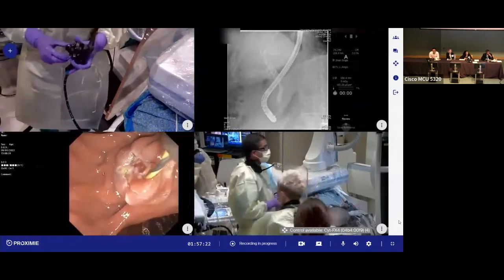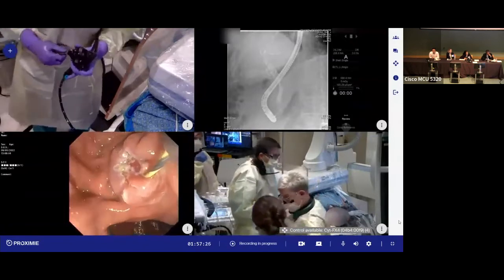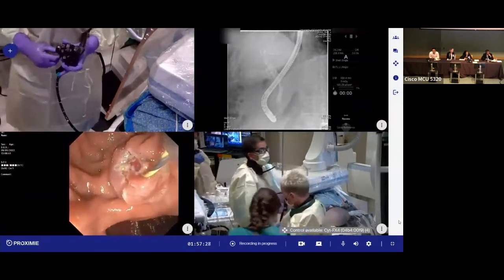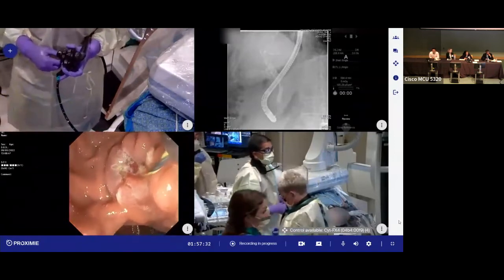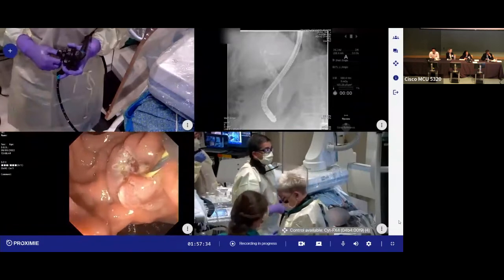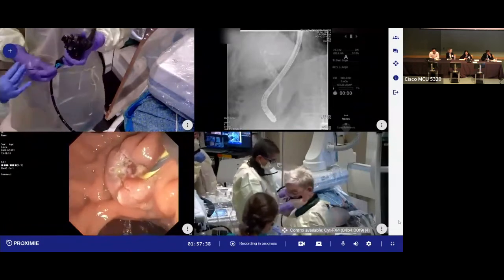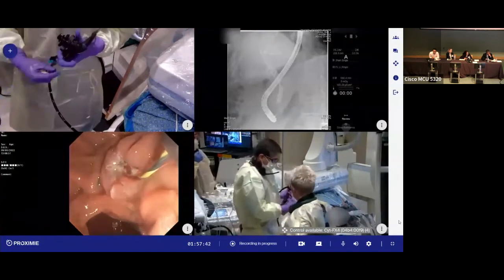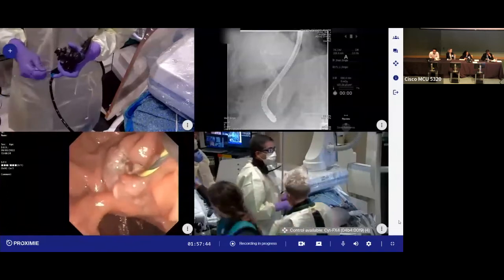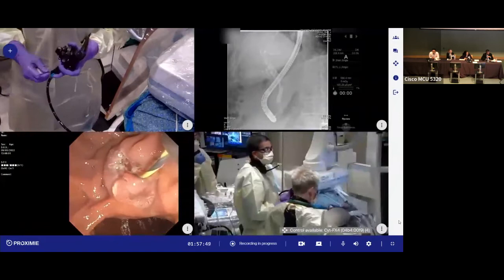Yes. I think you will see that patients will have, just above the papilla, a little bit of fibrosis or even a short segment stricture that's inflammatory, and you have a lot of trouble getting to it with the sphincterotome and cutting through it. So I think that's maybe another advantage of the dilation, as you break that up, and it speeds up the case, especially with multiple stones, because you can rapidly extract them and you don't have to spend time trying to work that balloon down through that fibrotic orifice.